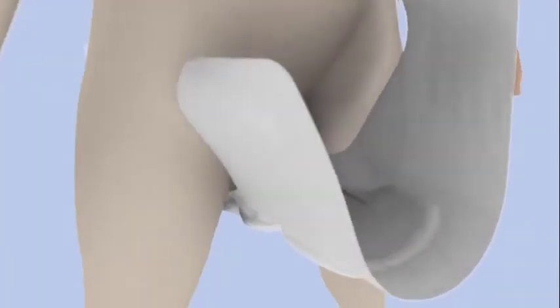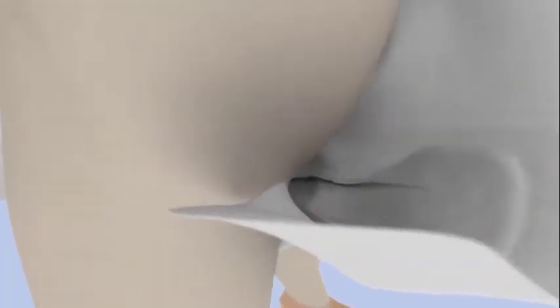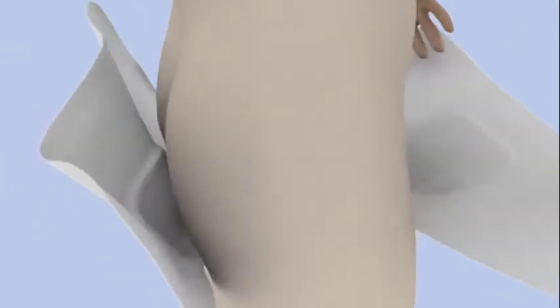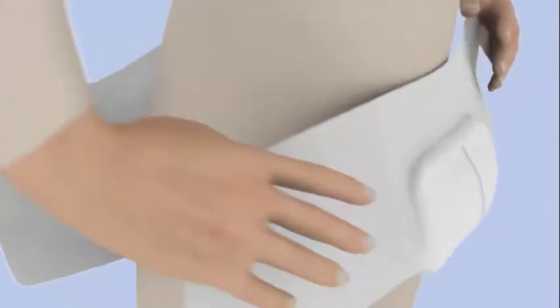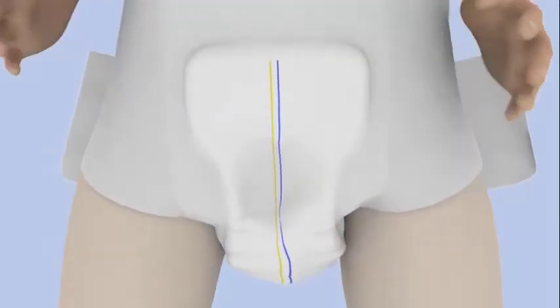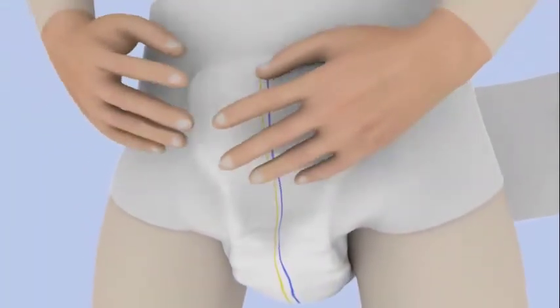Then pass the IDExpert SLIP between the legs from front to back and fan out the ends, ensuring the top rear end is positioned at the coccyx. Make sure that the end with fixation tapes is placed at the back. Ensure the pad is centered correctly using the wetness indicators as a guide.